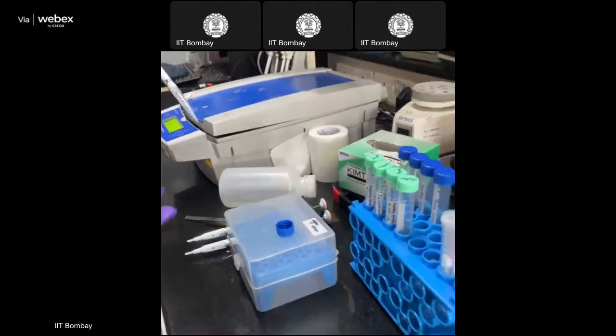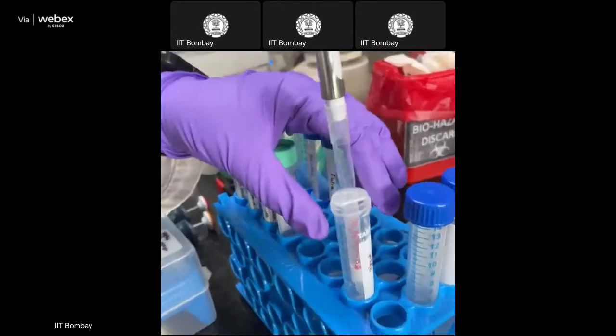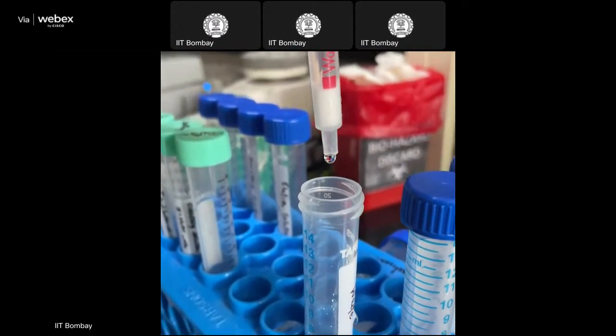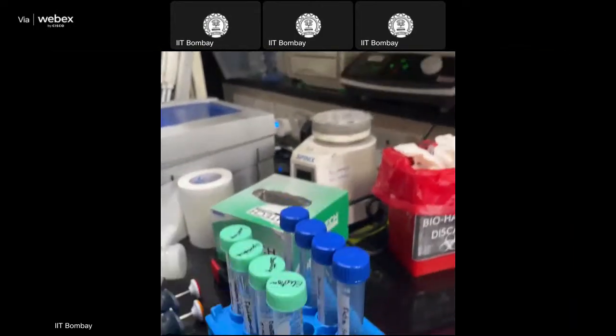So after adding the solution, you need to apply pressure so that the bubble should not come into the sample. For that, we can cut the tip.